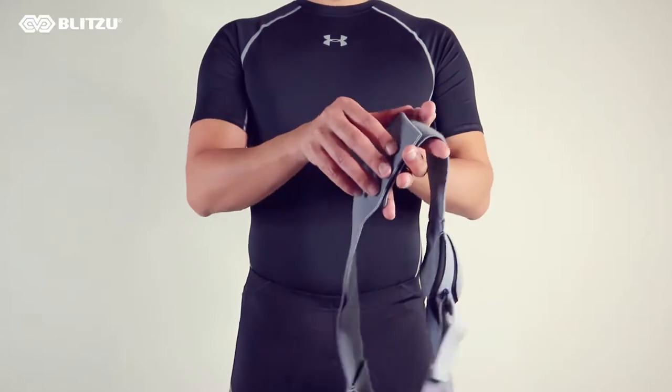Hello, this is Max with Blitzu and I'm going to show you how to put on your hernia belt.